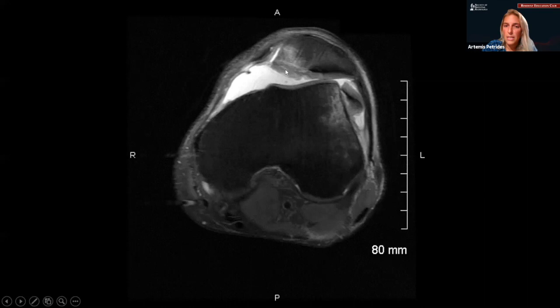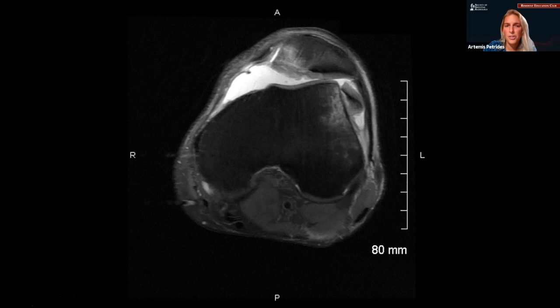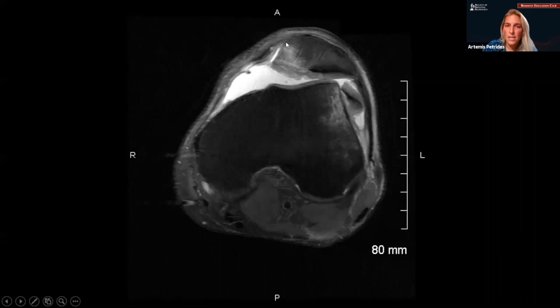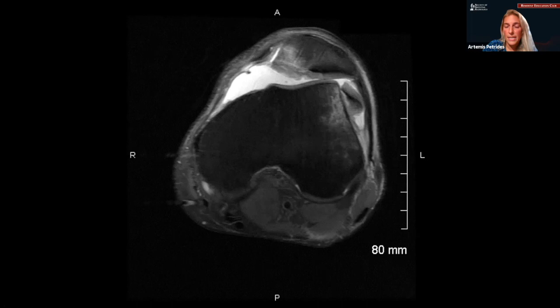If you look at the articular surface of the medial patellar facet, there is irregularity compared to the lateral surface. In the lateral aspect of the joint, there's a structure with imaging characteristics of both bone and cartilage — this is actually the cortical line, and it's a fragment of an osteochondral fragment that originated from the patella. Looking at the medial retinaculum and MPFL, even though it is not torn, it has attenuated morphology in areas, redundant morphology in others, and increased signal at its attachment, indicating at least some partial tearing. Putting these findings together, this is a classic example of a transient lateral patellar dislocation.